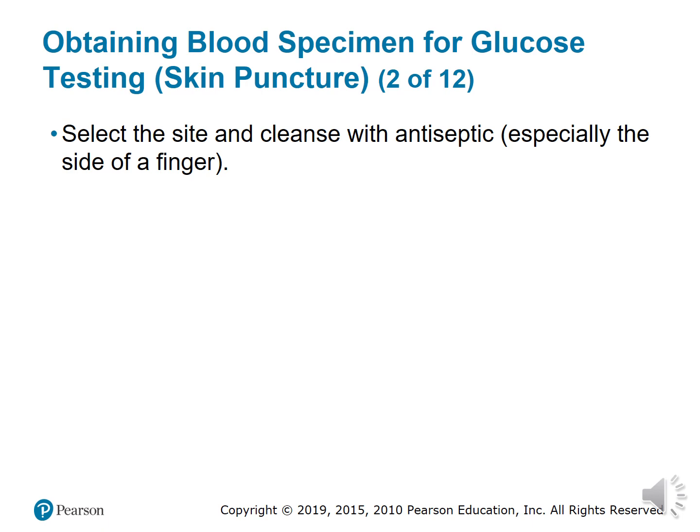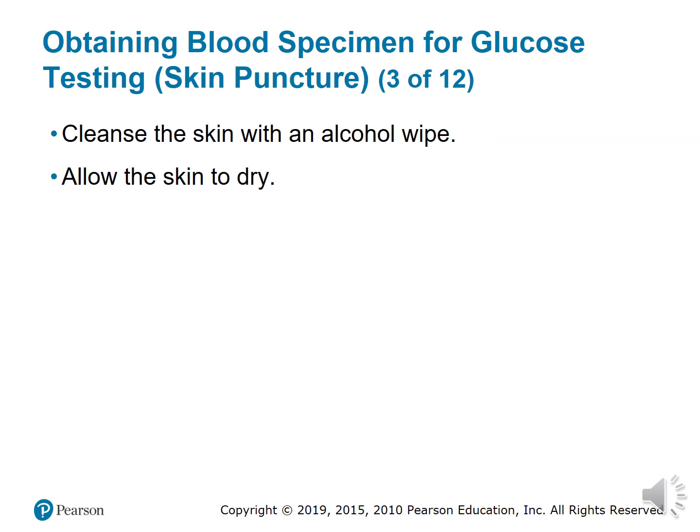Make sure you select your site and clean with antiseptic, especially the sides of the finger. Remember how I told you how to wipe off a patient's finger? And if you have to do it more than once, do it more than once. Always make sure once you clean the skin with an alcohol wipe that you allow the skin to dry properly, and I mean fully dry.